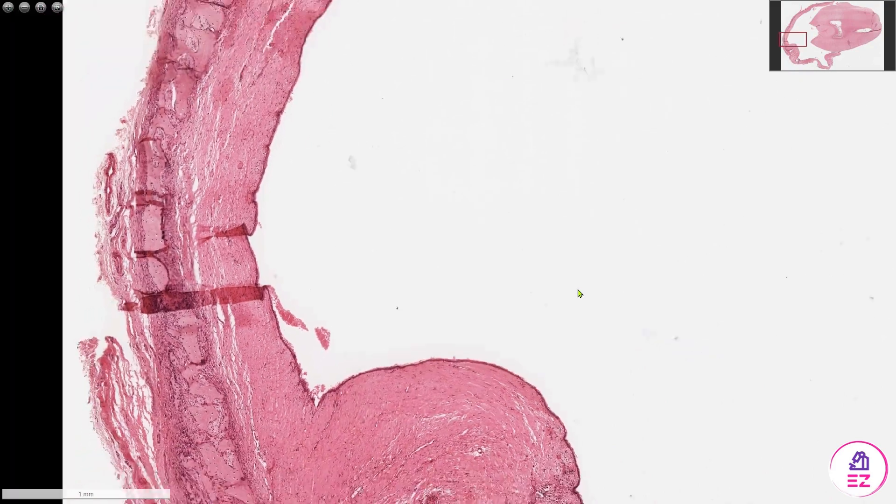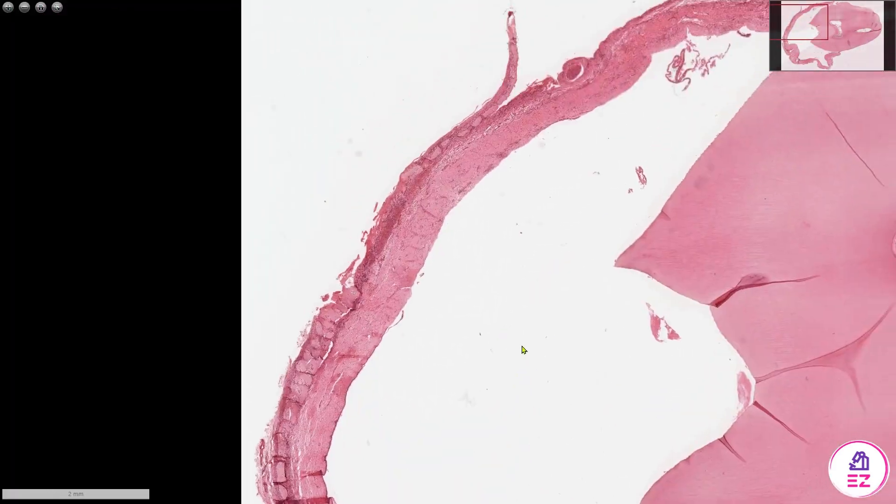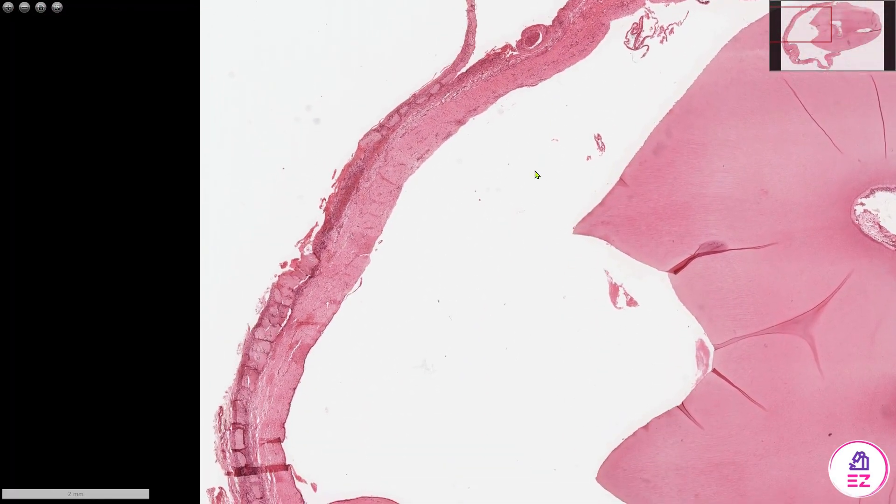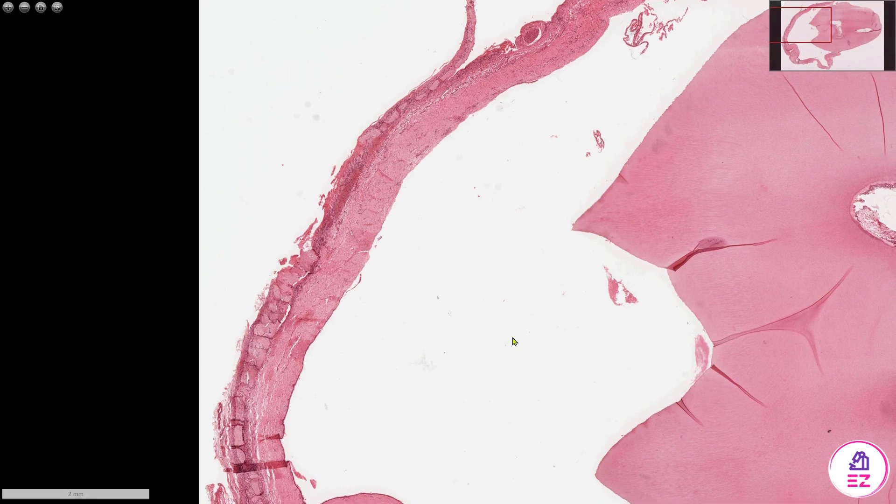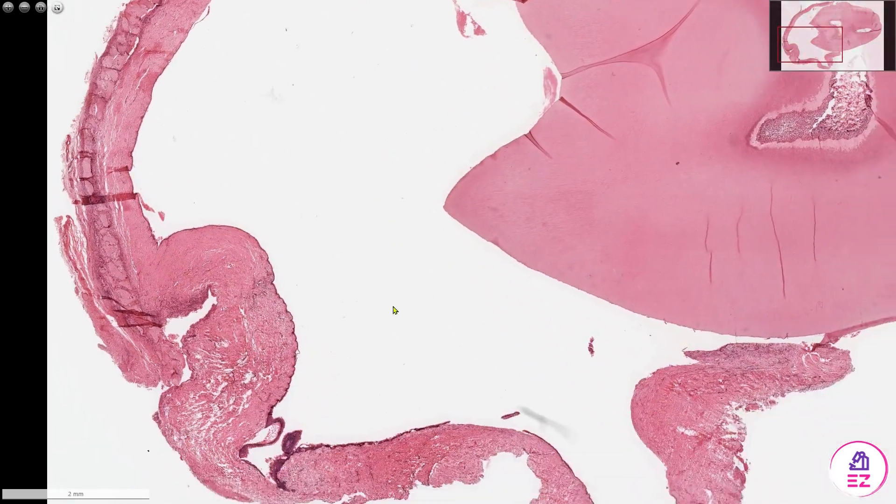And then the lumen, in this case, is virtually empty of any material. So again, in contrast to the radicular cyst, I'm not seeing lots of inflammation, cholesterol crystals, anything like that. This would have probably been filled with some form of fluid.